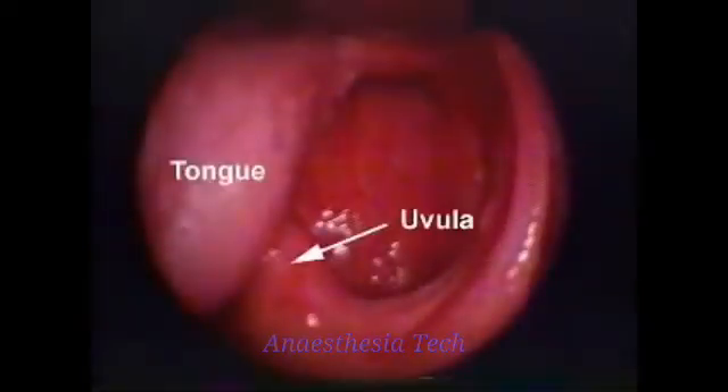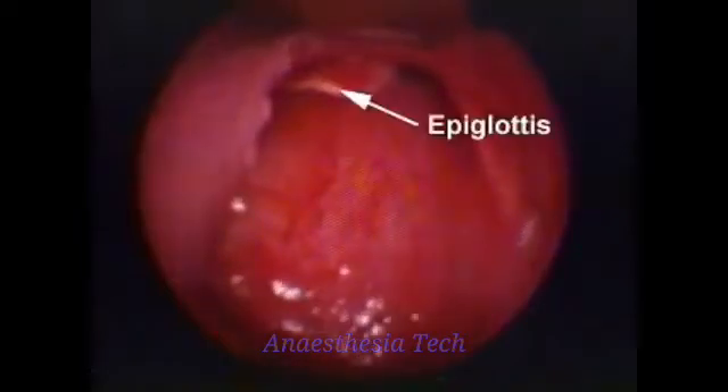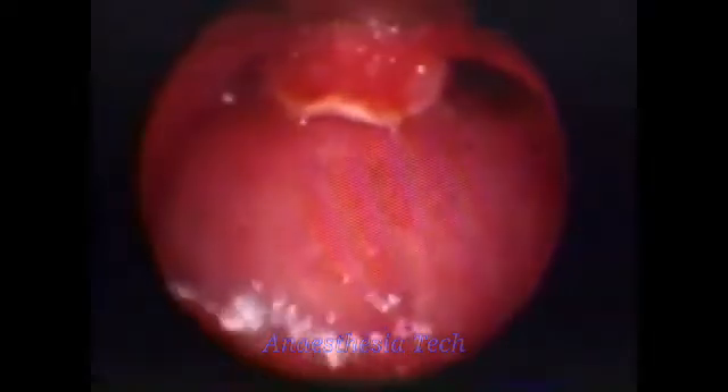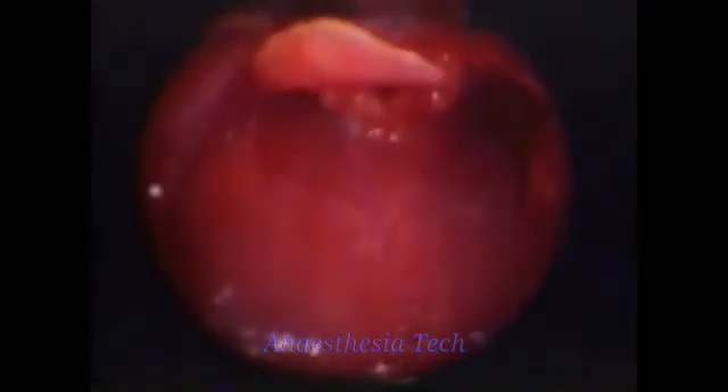Advance the laryngoscope blade down the midline until the epiglottis is visualized. For a curved blade, slide the tip of the blade above the epiglottis until it stops in the vallecula. For a straight blade, the tip of the blade lifts the epiglottis.